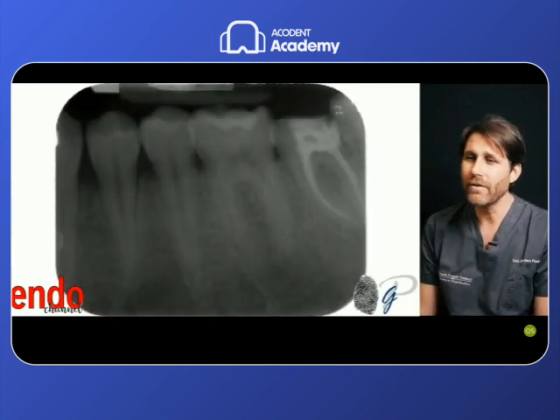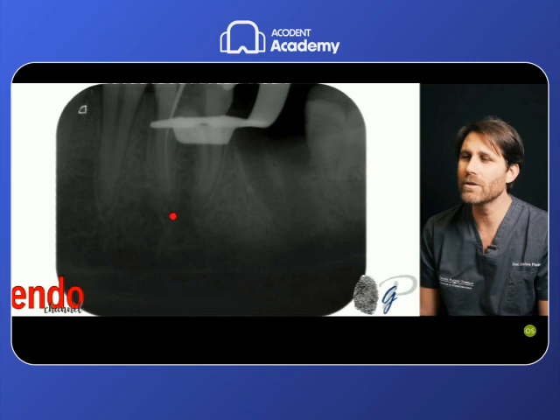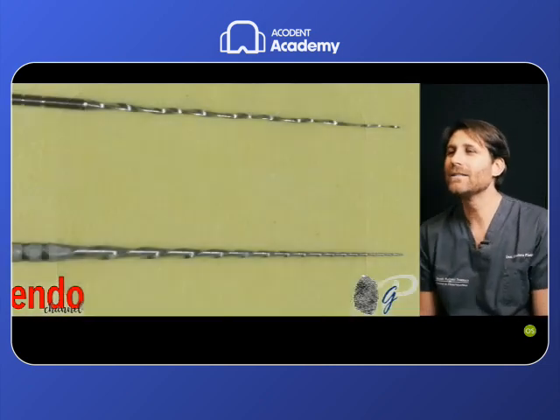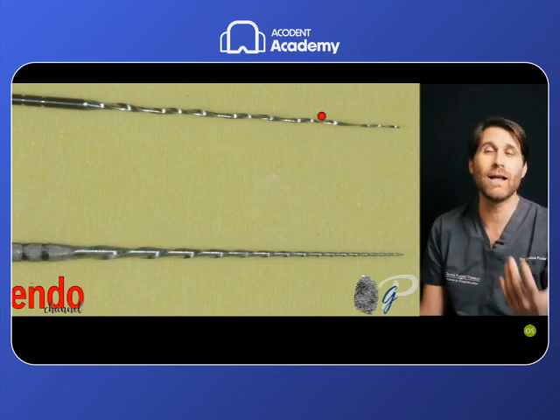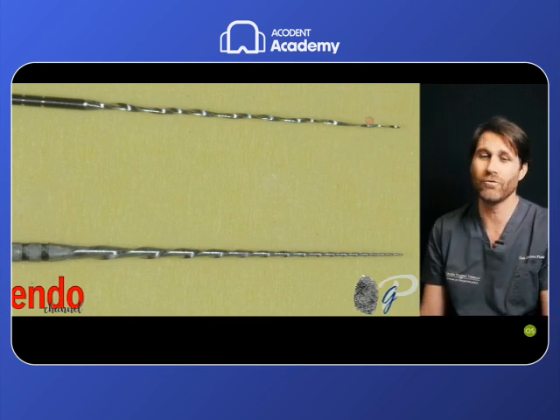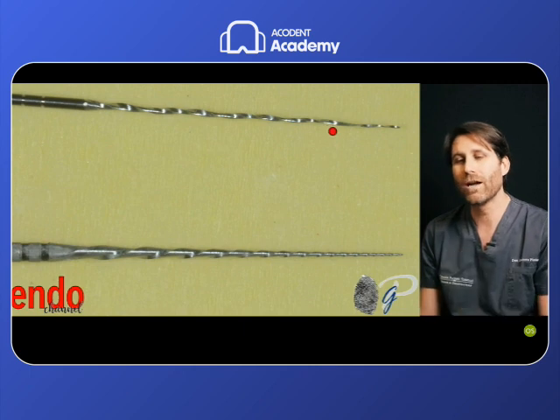This is another case, in a lower molar, in which we tried to scout the apical third manually, but I was not able to reach the final working length under the control of the apex locator. I still missed 1 or 2 millimeters. Again, I used another file in rotation, trying to scout this root canal mechanically, and again I had a deformation, and I was lucky that in rotation I had no fracture. But I had a deformation because of the risk given by the rotation in these cases, and probably also the design of the file not made specifically for this purpose.